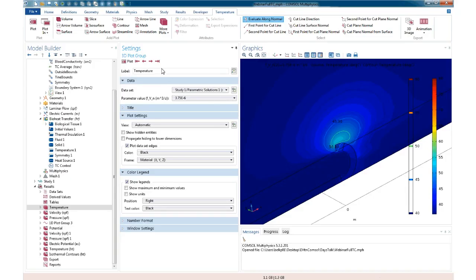Okay, is there anyone who thinks that this new lesion is the same size as this old lesion? As a matter of fact, if you look carefully, the surprising thing you're going to see is that the variation I was trying to correct when I was using old crude voltage feedback was smaller than the variation I've introduced by putting in this new temperature feedback. This is an extremely surprising result, or at least many people I've shown this to are very surprised. So, for those of you who saw this coming, congratulations, you're very good at this.